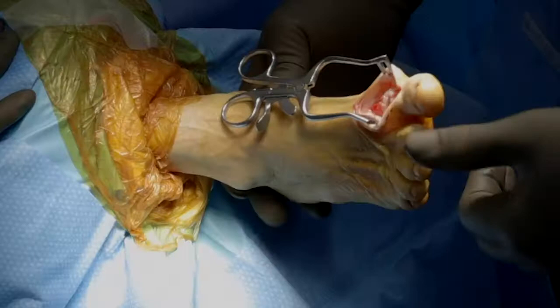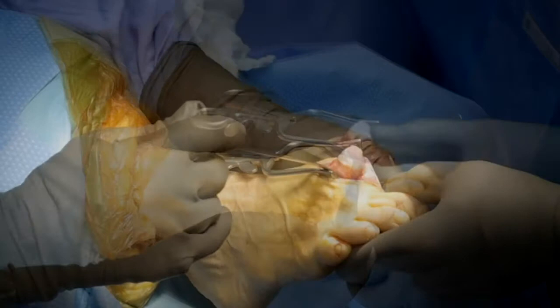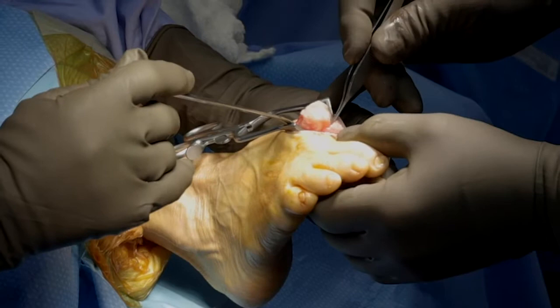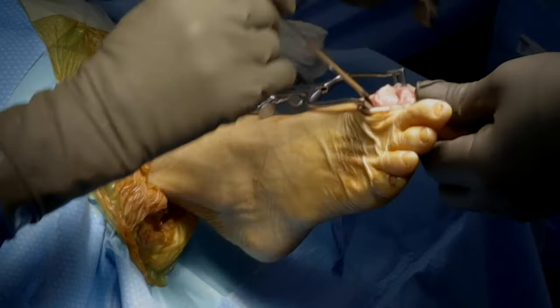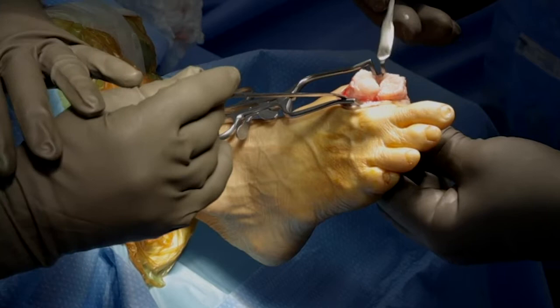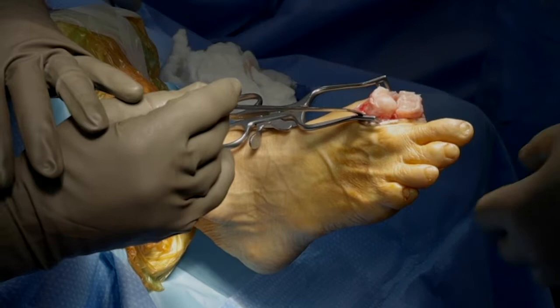You have to do the soft tissue releases. If you don't do the soft tissue releases, you're not going to get a good outcome because this is a disease. The cartilage surface that's been damaged is a lot of the medial side here, going almost down to the plantar surface. The grooves themselves are in pretty decent condition for the sesamoids, but she's completely worn off the medial side of her metatarsal head for quite a bit. I'll decide whether I need to do a total toe or just a partial. There's a lot of eburnated bone along the whole medial side here, and if you took that off she would be unstable, so we just want to resurface this. She's a perfect candidate for a total toe replacement.